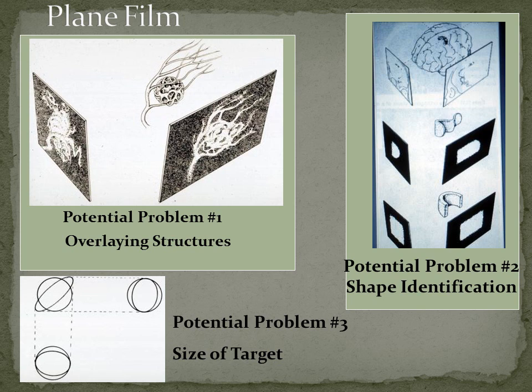Now, it doesn't matter in a lot of the work we do in neurosurgery that you actually know the exact shape at any point in time, and knowing the point where you are is sufficient. But for doing conformal treatments, it really does matter that you can tell that you don't have a bullet-shaped lesion, that you don't have actually a spherical or a rectangular lesion.